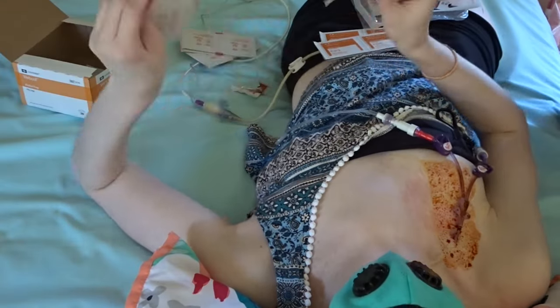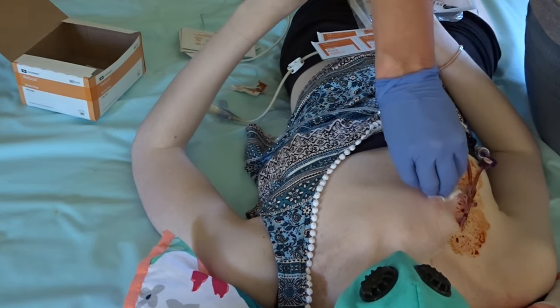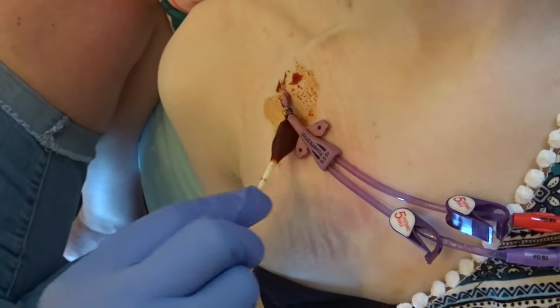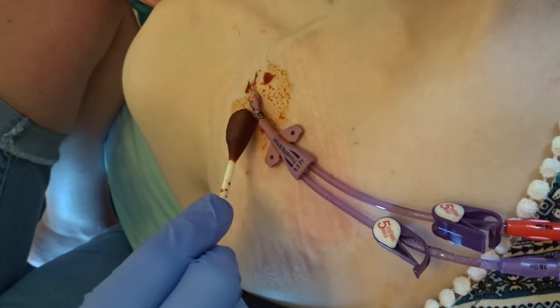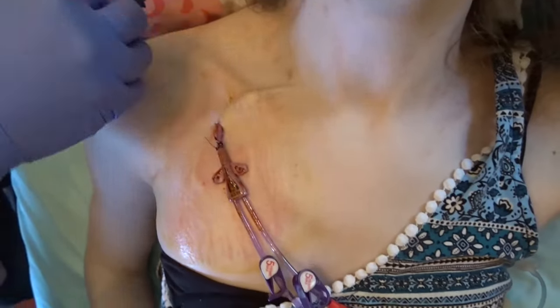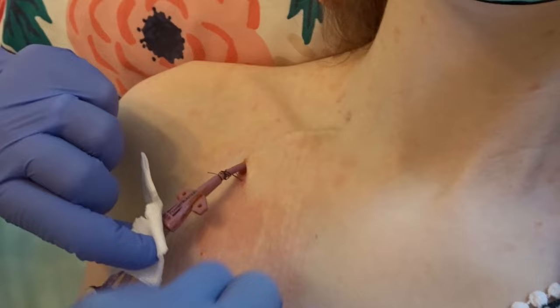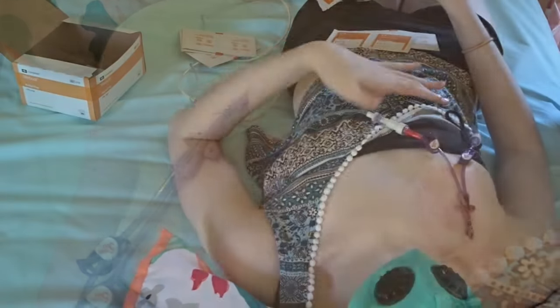My skin and the line are both wiped with betadine. To remove the orange residue, we clean with alcohol afterwards, carefully avoiding the actual line. If the line is stitched in, clean the stitches very well — they can potentially harbor bacteria, leading to infection. The line inevitably has to move around for a thorough clean; that is where the gauze on the sterile field comes into play. Use that gauze to maneuver the line.